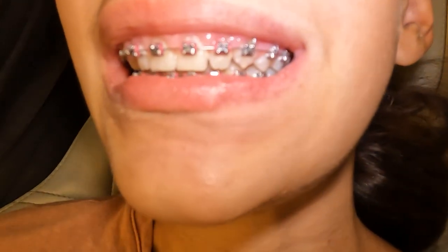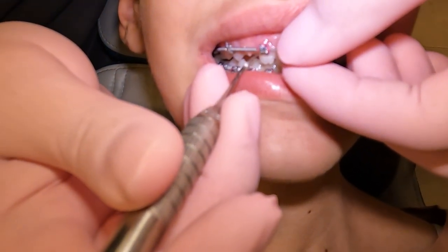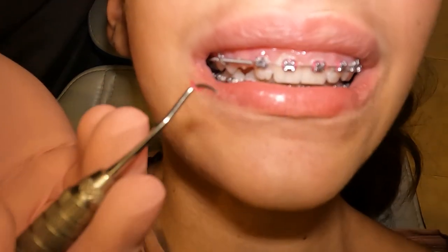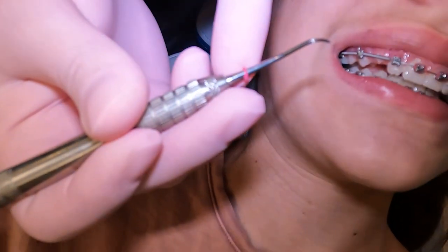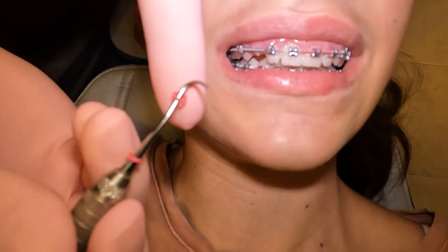Let's show you what it's like to get these off. We have a little scaler here and we use this instrument to get under those colors — and then there it is, look at that, one and done — and go all the way around. That's number two, three.